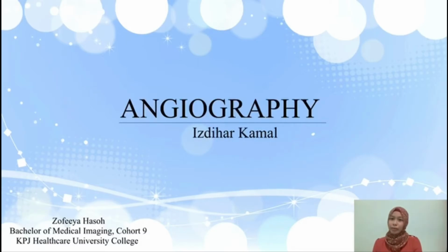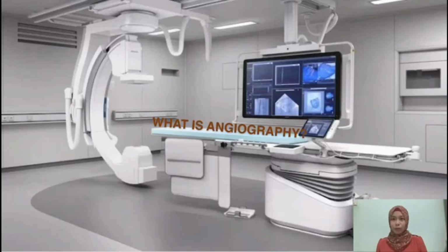And today, I'm here to talk about angiography. Let's get started. I'm going to start with what is angiography. So, angiography is an imaging test that uses X-ray to view your body's blood vessels. The X-rays provided by an angiography are called angiograms. This test is used to study narrow, blocked, enlarged, or malformed arteries or veins in many parts of your body, including brain, heart, abdomen, and legs.